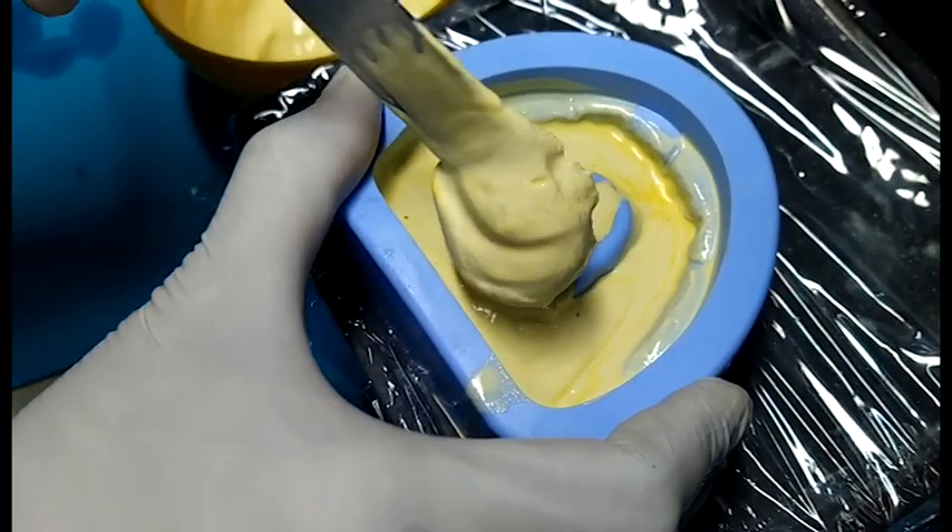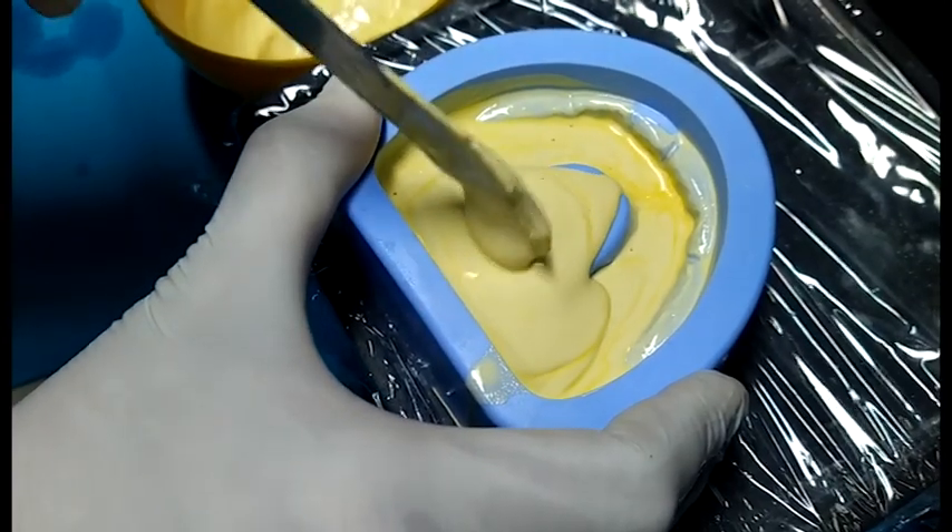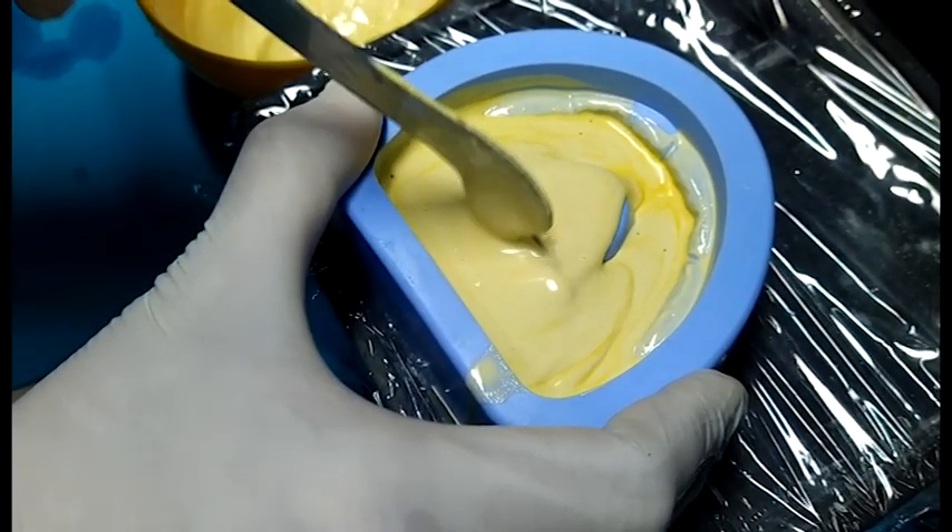Now fill the remaining dental mold with the dental stone plaster.